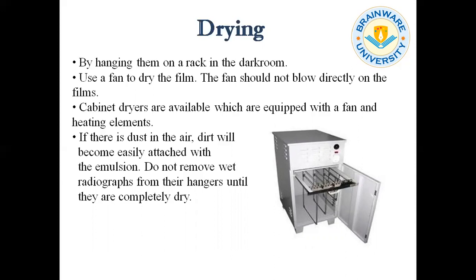In that picture, you can see a dryer. Here you can see various sizes of hangers, and this cabinet is equipped with a fan and a heating element. If there is dust in the air, dirt will easily attach to the emulsion.